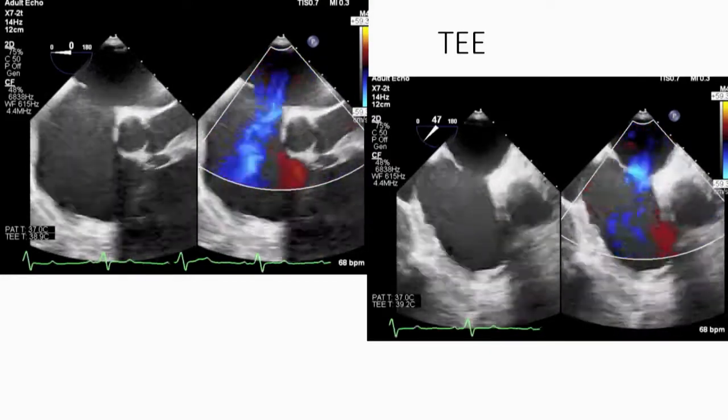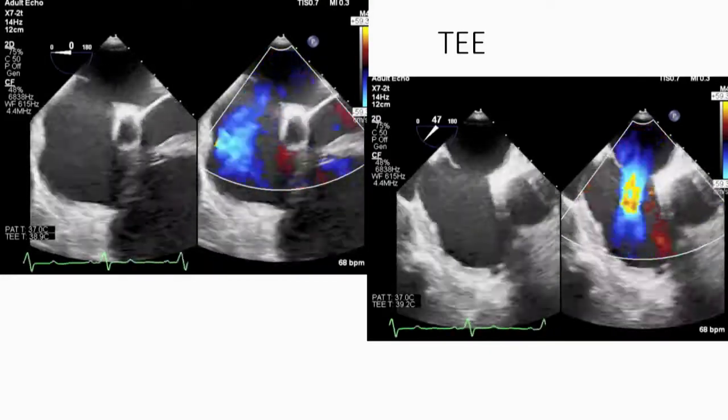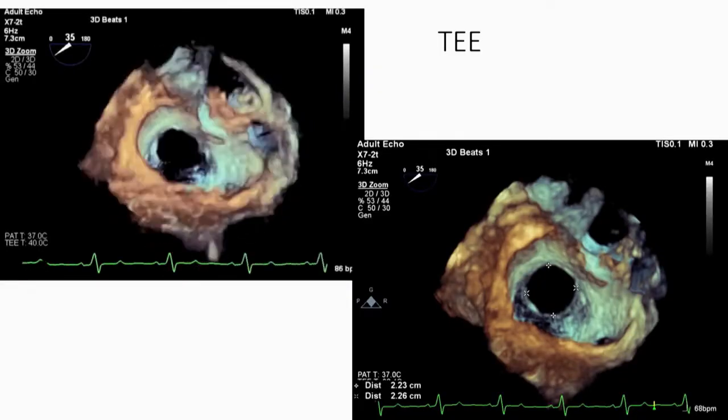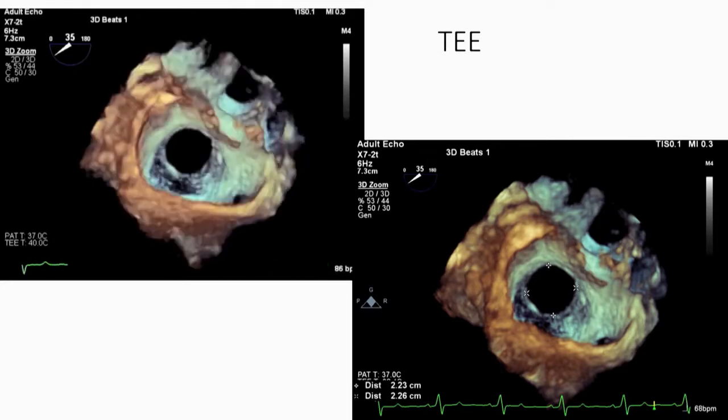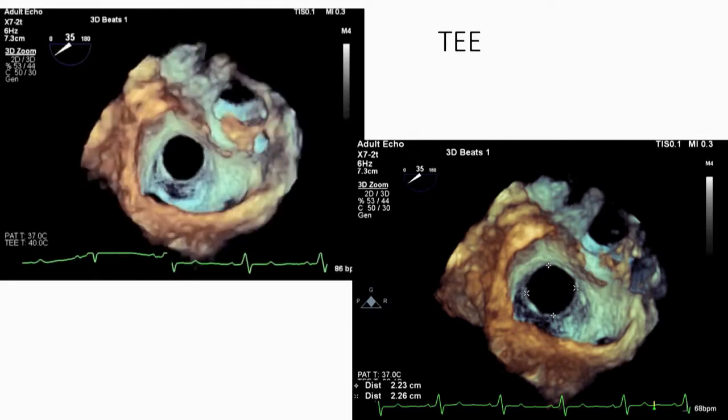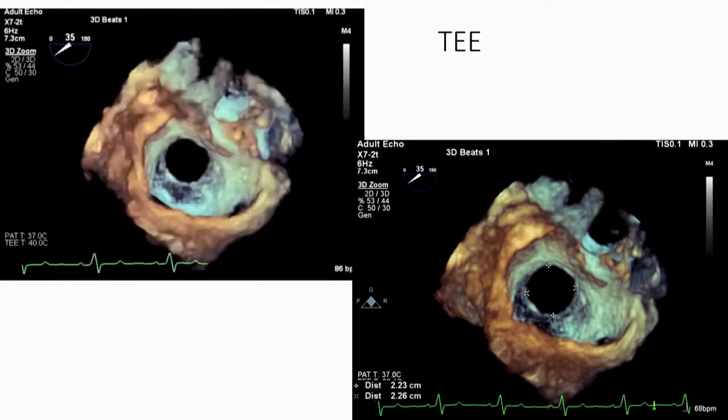Now we have done a coronary angiogram too. Okay, fine. Now color out. There is only mild coronary artery disease with mild disease in the OM. RCA and LAD are normal.